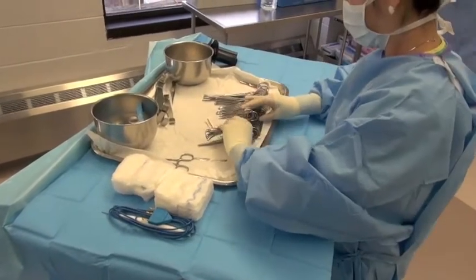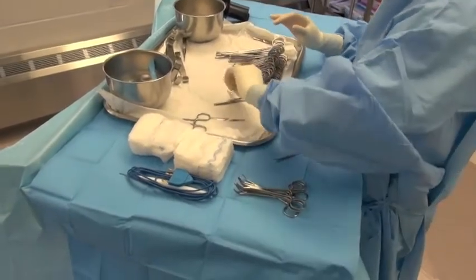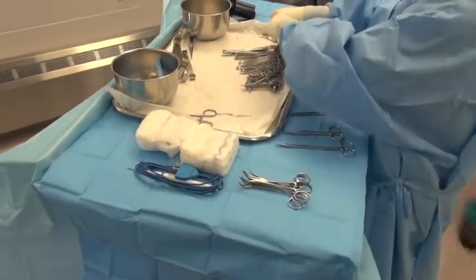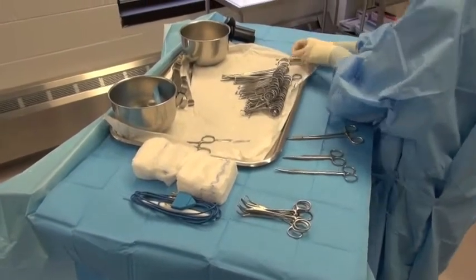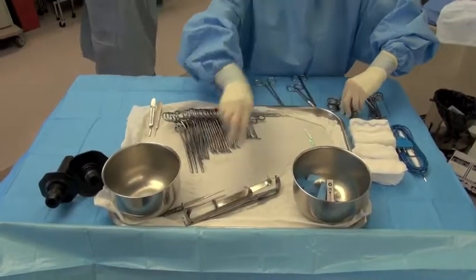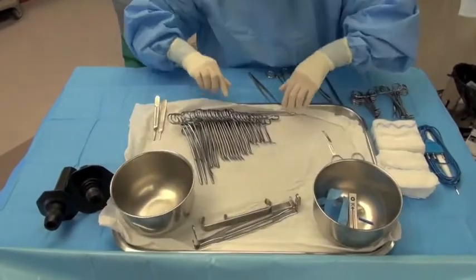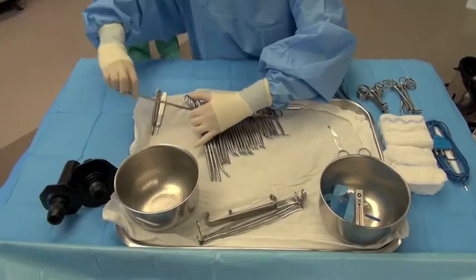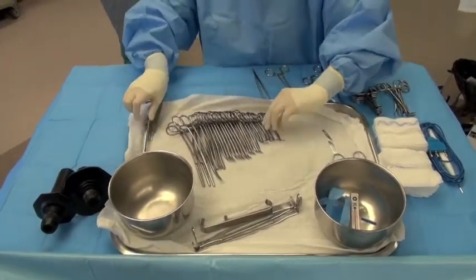Arrange your instruments in a way that is amendable to what you may grab during the draping and how you may do a procedure. Towel clamps are typically going to be placed closer to the edge, and then you're going to line up your scissors, your Mayos, your Metzenbaums, and your needle drivers along the edge in front of the tray. We typically try to keep most of the sharps on the metal surface of the tray so it doesn't penetrate through to the table and potentially cause contamination.